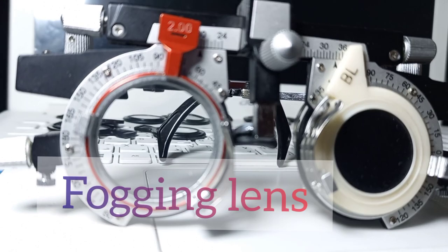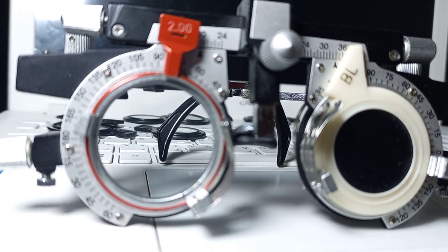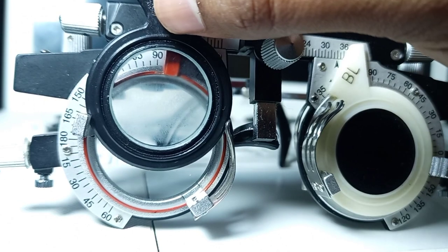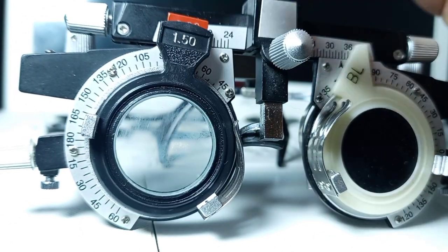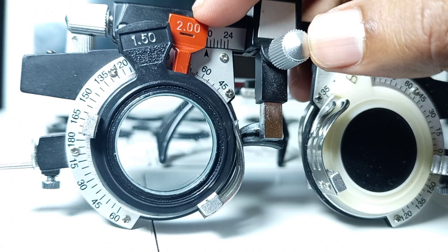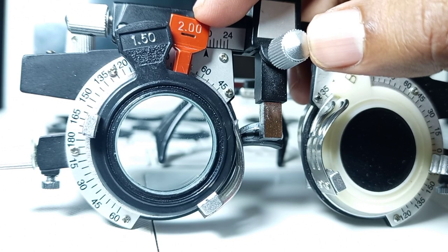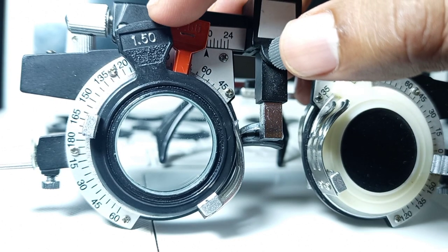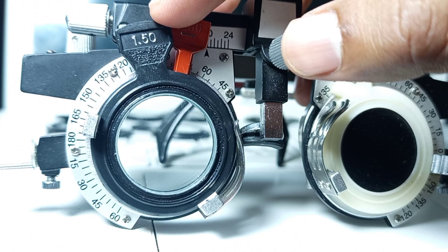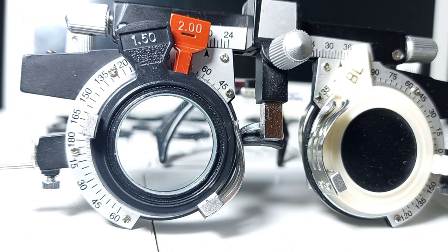Now we will add the fogging lenses before the patient's eye, and these fogging lenses will reduce the visual acuity of the patient. Plus spherical lenses are the fogging lenses. We will add plus 1.50 spherical as fogging lenses, so the total spherical correction is minus 2 plus the fogging lens of plus 1.50. This fogging lens will reduce the visual acuity from 6 by 9 to 6 by 18.